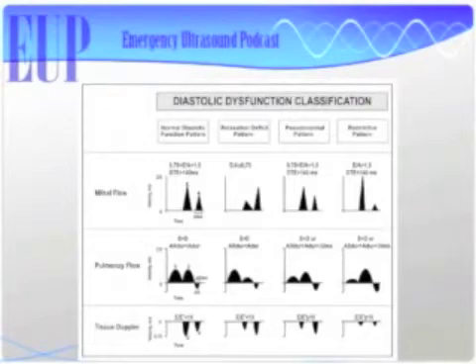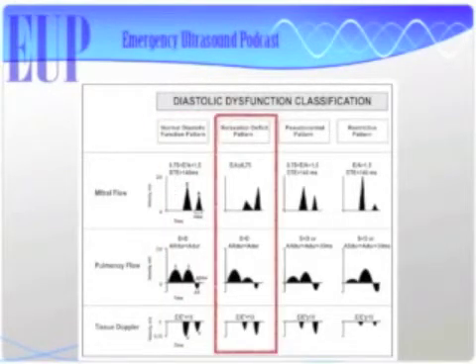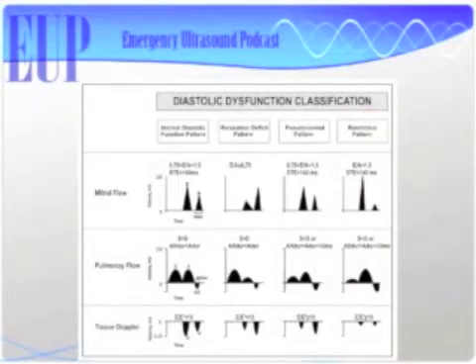So here we are with diastolic dysfunction classification. Now we're looking at normal here, normal relaxation deficit or impaired relaxation, and then pseudonormal is the third row up on the top, and then restrictive is the fourth row up on the top. So mitral valve flow here appears to show that E is greater than A in normal diastolic function, E is less than A in relaxation deficit, E is greater than A again in pseudonormal, which is where we need to use that TDI to tell the difference. And then in restrictive, E is ginormous and A is super tiny. And that's typically how people determine whether somebody has restrictive filling or not.